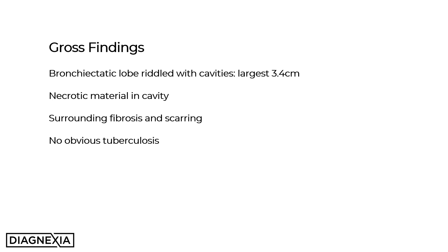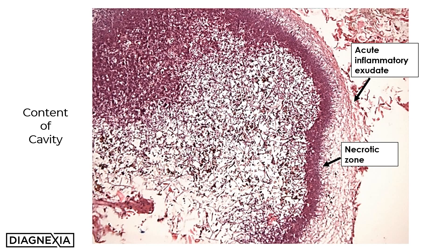Within the cavities, necrotic material was identified. The surrounding lung parenchyma displayed fibrosis and scarring, and there was no obvious active tuberculosis noted. This is a low-power magnification of the contents of one of the cavities. You can see that the outer rind is formed by acute inflammatory exudate.